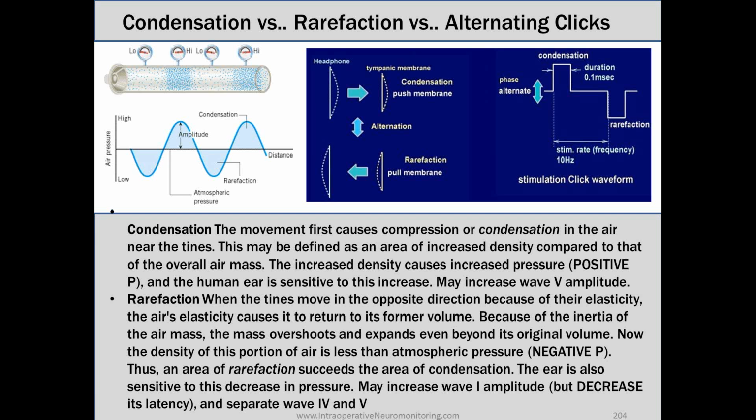When we stimulate, we have 3 choices here. We can stimulate with condensation, rarefaction, or alternating clicks, and this has to do with the pressure and the way the tympanic membrane is bounced, pretty much.